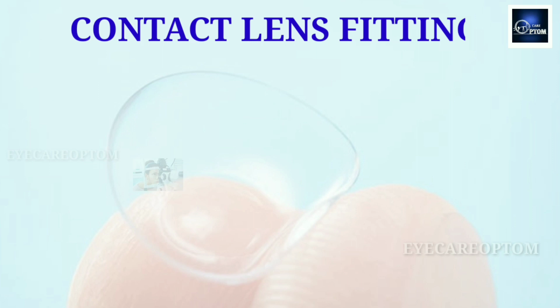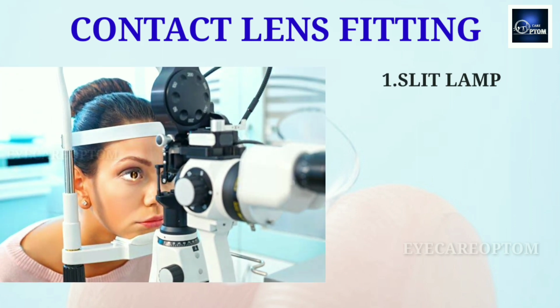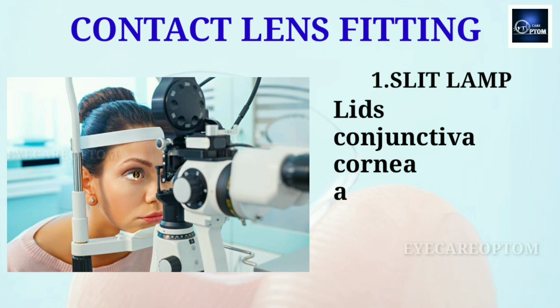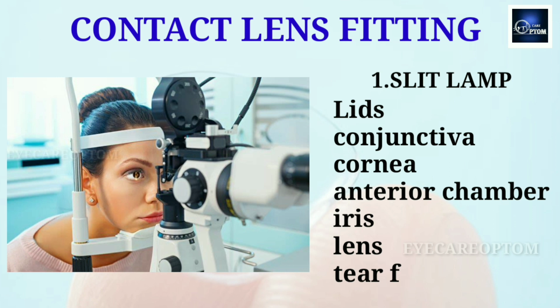The first one is slit lamp examination. This is to identify any pathology in the anterior segment or in the eye adnexa. We should check the eyelids, bulbar and palpebral conjunctiva, cornea, anterior chamber, iris, lens and tear film.